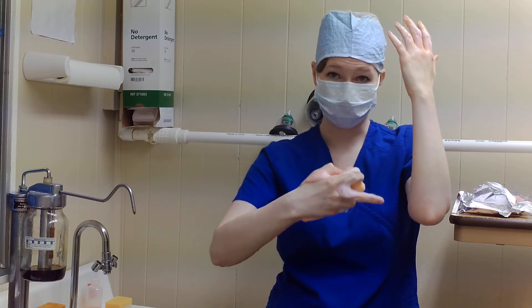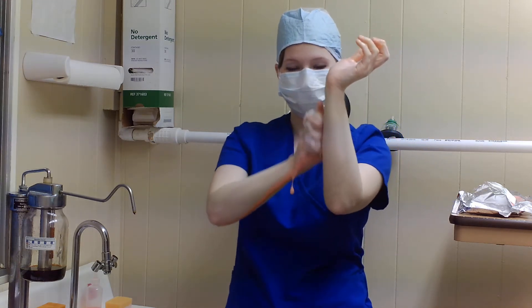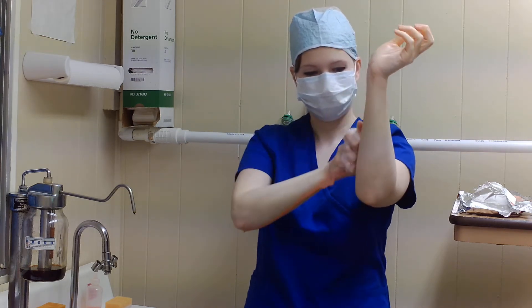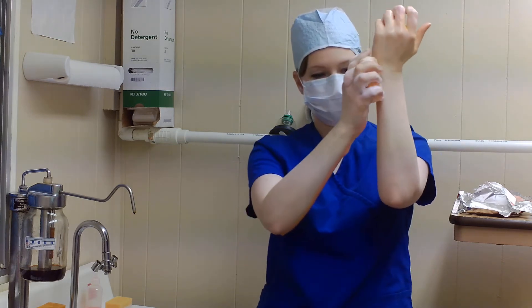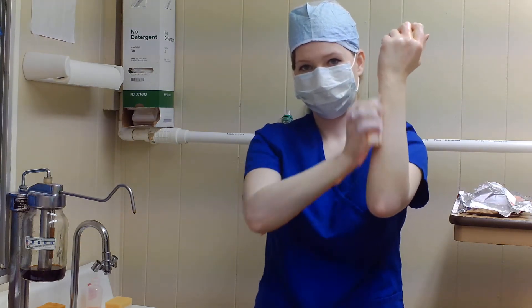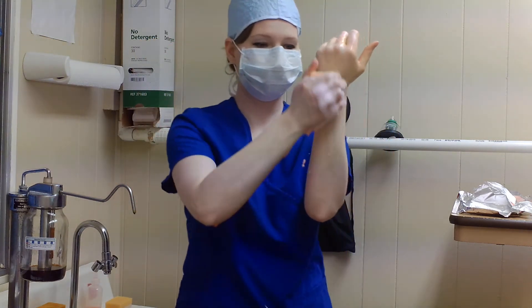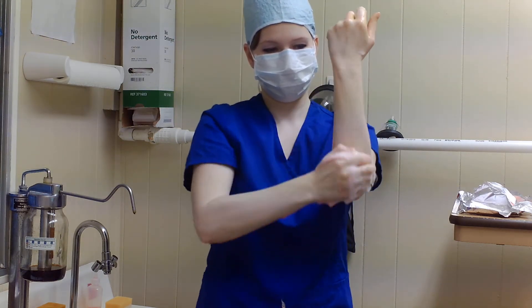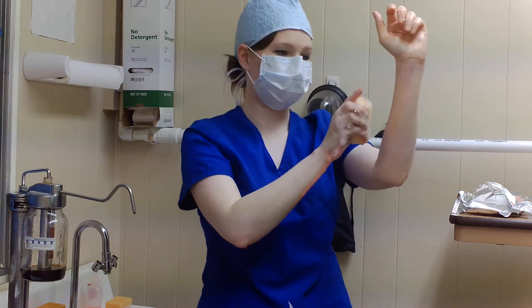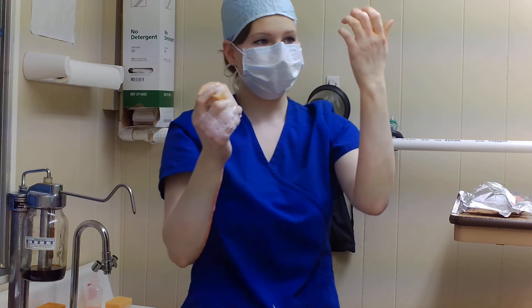Now I'm going to do my forearm. The whole time you've got to remember to keep your hands above your elbows. You don't want to bring them down and wind up with all that dirty water coming back to your hands, because your hands are supposed to be the cleanest part of all of this. Second plane, third plane, fourth plane — alright, that one's done.